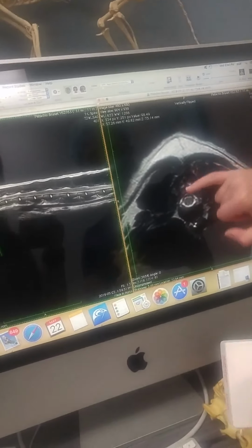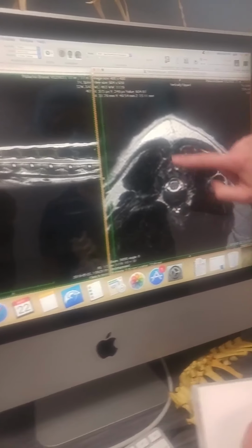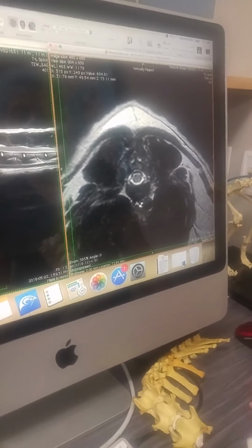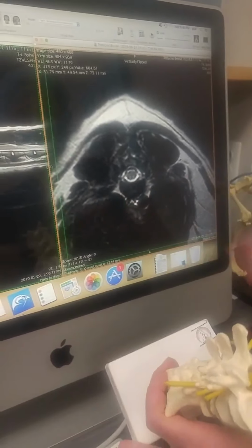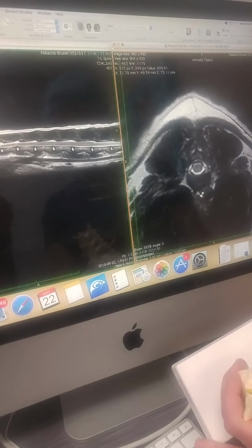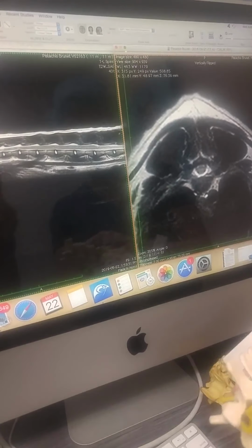Like that, okay. So top of the vertebrae, and I can make it a little bit more clear. Top of the vertebrae, that nice and round structure in the middle, which is gray, is my spinal cord. Okay, so that yellow bit. And then underneath here is my body bone, and if I go on top of just there, that's disc. That's the disc in between.